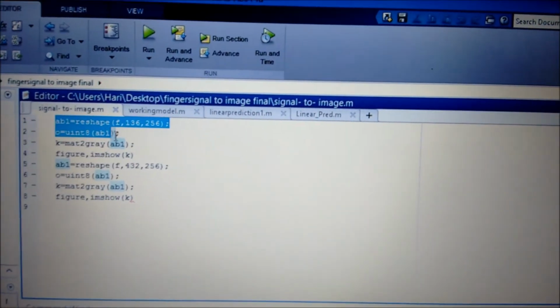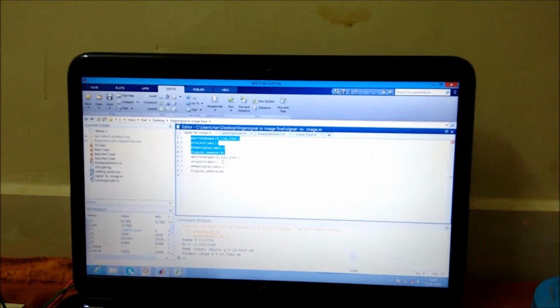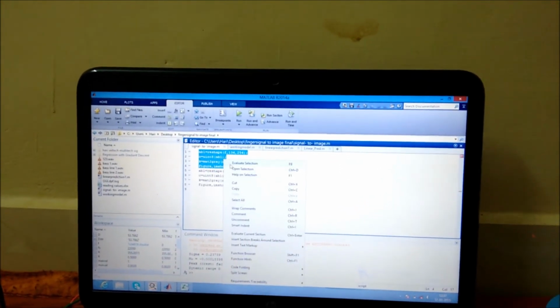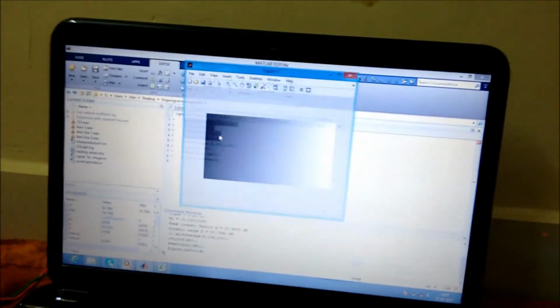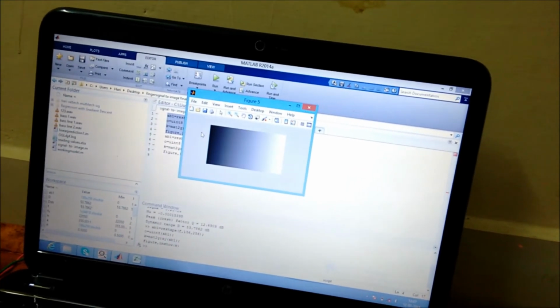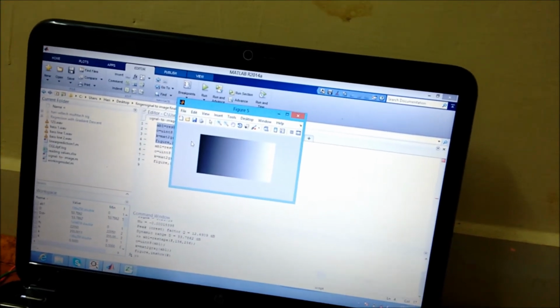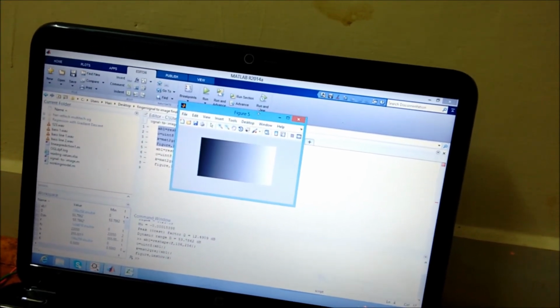After obtaining the 4 values, sigma, mu, peak factor and dynamic range, they will be displayed in the command window. If the signal length is longer, then during the execution of signal to image conversion, the image will break, and then it will be realigned, and the output will be displayed as shown in figure 5.